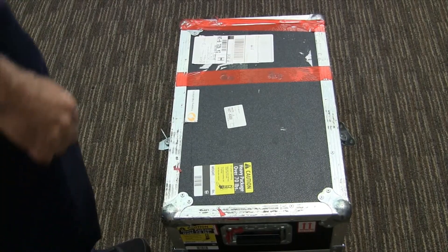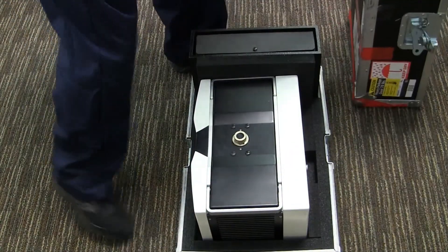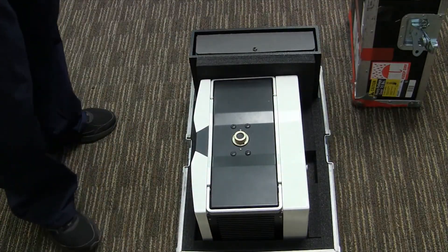Once you've removed the latches, you can now lift the cover to the shipping case. Next, inspect for any visible damage.